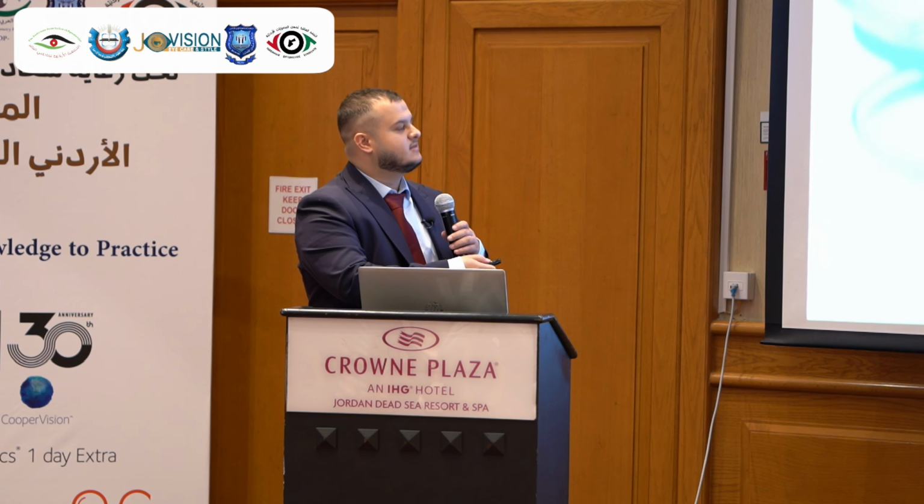Now we'll ask, what is Ortho-K? Simply, Ortho-K is a non-surgical method used to correct vision by reshaping the cornea. It's an RGP contact lens, designed especially to control myopia. It's safe, non-invasive, well-tolerated, temporary, and reversible.